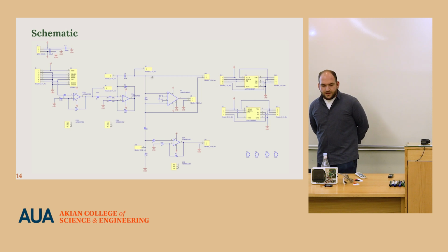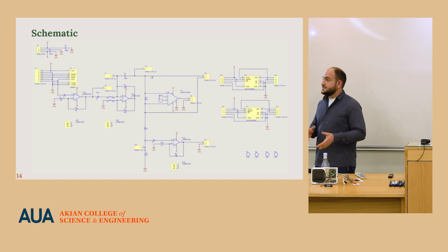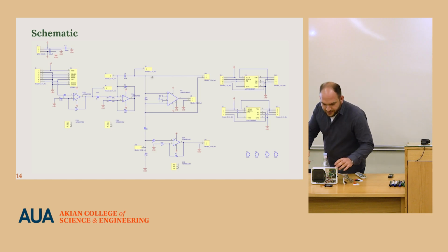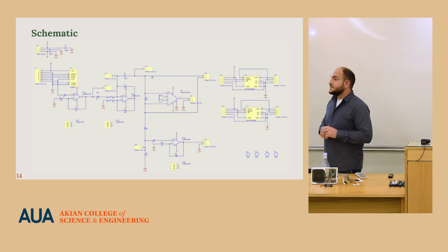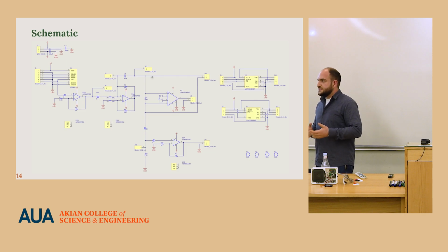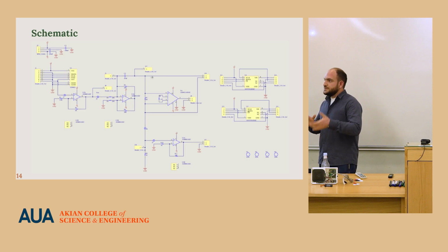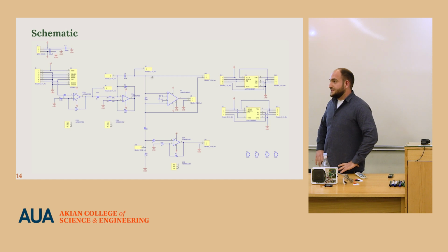As we already mentioned, we have some interface. We use the LabVIEW environment. LabVIEW, I know LabVIEW, but LabVIEW is just for capturing and providing the data. We can also use LabVIEW for logging this data, so it can be used in further investigation of the problem for the monitoring. Do I understand your question? Yeah, correct. I think so, but the doctor will not accept it.